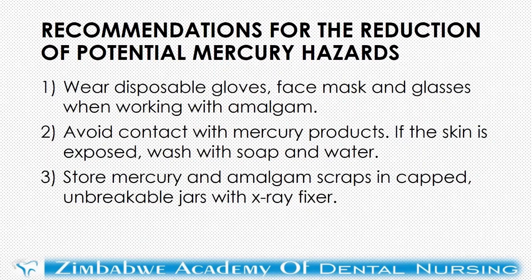Need to put on gloves, face masks, goggles or glasses, avoid direct contact with the amalgam itself. The leftovers of amalgam must be stored properly, usually in a sealable jar with water or fixer.